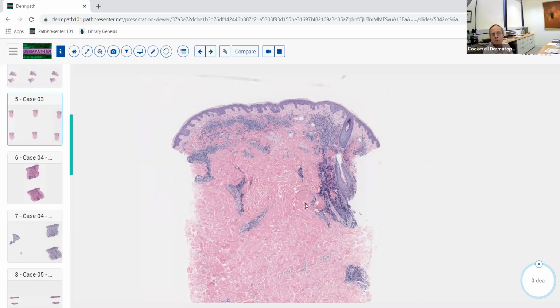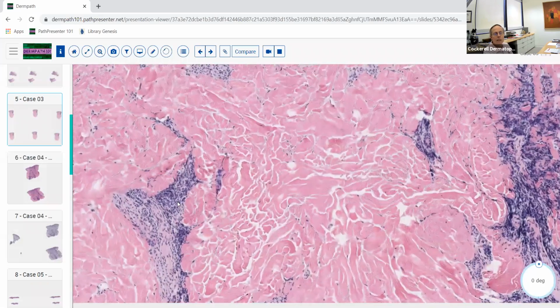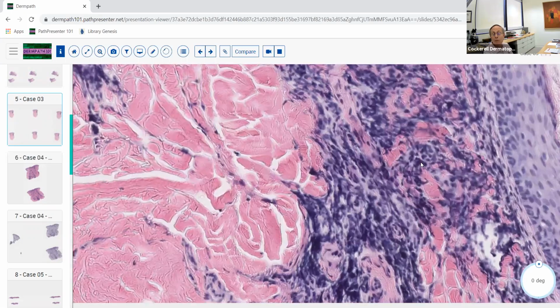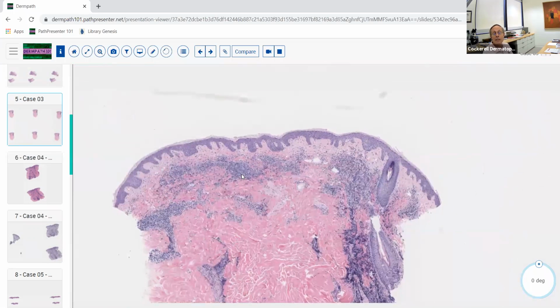Which is erythema chronicum migrans, which is in the lymphocytic infiltrate differential diagnosis of erythema annulare centrifugum, that sort of thing, which is also one of the lymphocytic infiltrates, or lymphocytic infiltrate of Jessner, which is kind of where that came from. But here, if you actually look at this, unfortunately, a little bit of a fuzziness to this high magnification, a number of these cells actually were plasma cells in addition to lymphocytes. And notice that there's an absence of mucin. So if you get this pattern that you see with mucin, you think about the tumid form of lupus erythematosus. If you see a prominent amount of papillodermal edema with no mucin, you think about polymorphous light eruption.